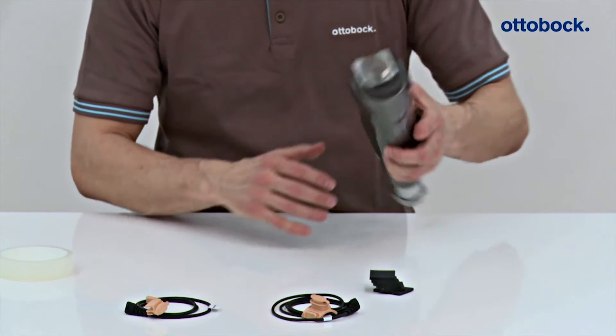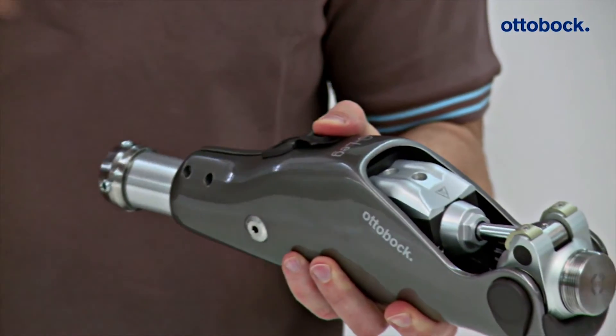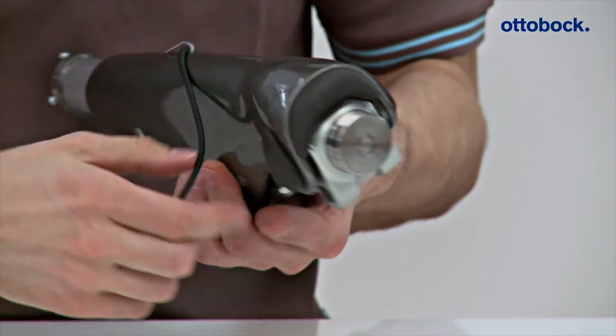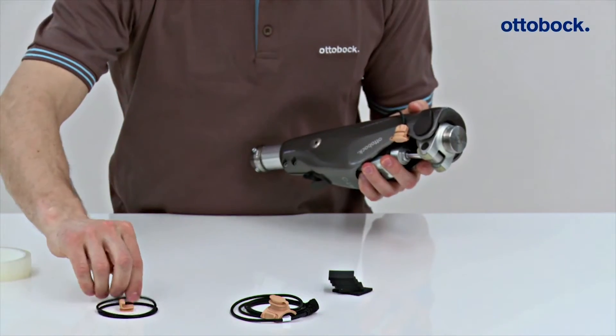4X157 installation: First, the O&P Professional opens the cover of the charging receptacle on the knee joint and then plugs in the charger extension cable. Next, the charging receptacle of the charger extension cable is plugged into the frame of the knee joint and the O-ring is then hooked into the bracket of the charging receptacle.